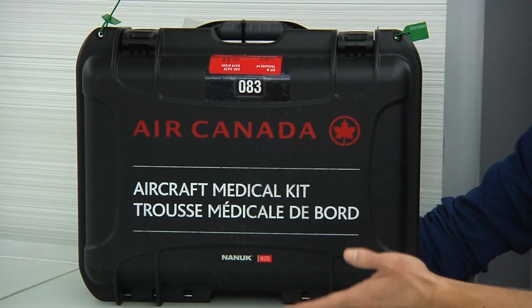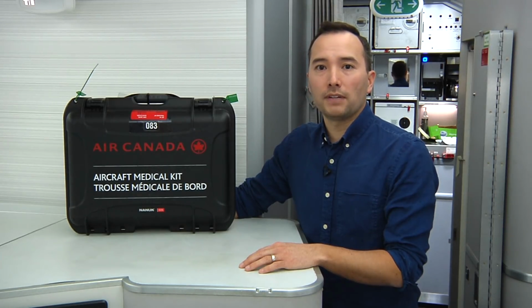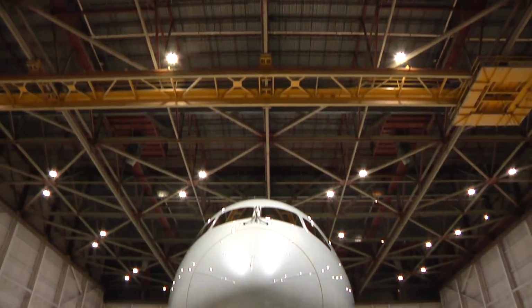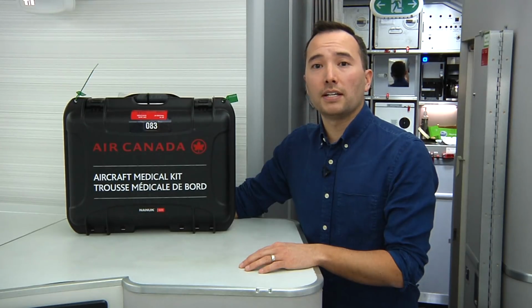in an in-flight emergency. In the event of a medical emergency, a flight attendant or member of the flight crew will provide you with this kit. Please be noted that once the kit is provided to you, it is likely that ground-based medical consulting services will have been notified to assist you in managing your patient.